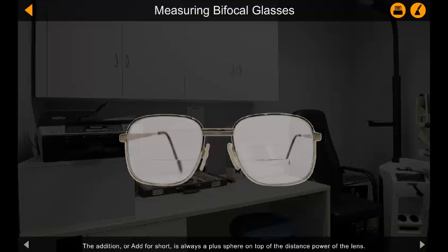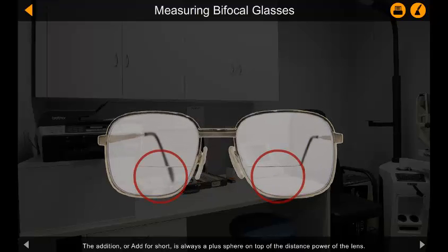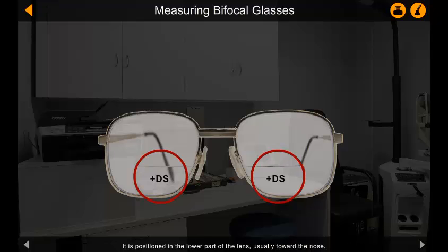The addition, or add for short, is always a plus sphere on top of the distance power of the lens. It is positioned in the lower part of the lens, usually toward the nose. It provides increased dioptric power for near-object viewing in cases where the eye cannot do this for itself.